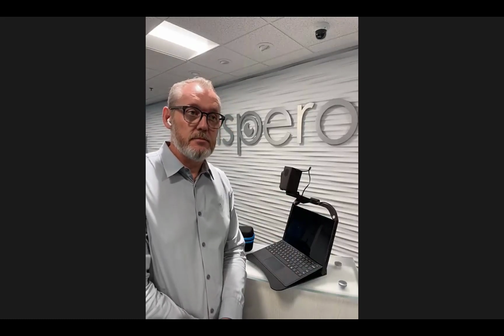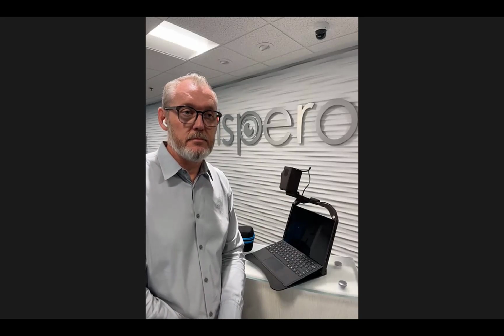James Fossey asks, is there voice output for the toolbar controls? That is a poignant question, and there is not currently. Good question. And then, let's see, could we buy only the camera and not the entire system, so that we can use it with any other laptop?